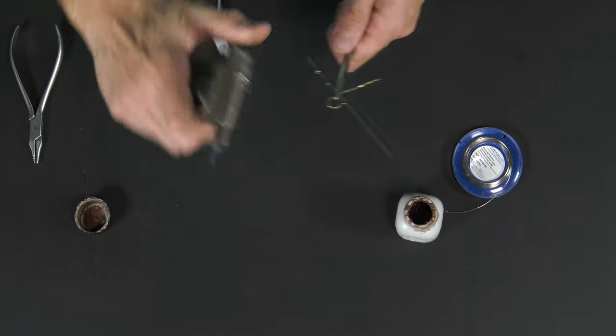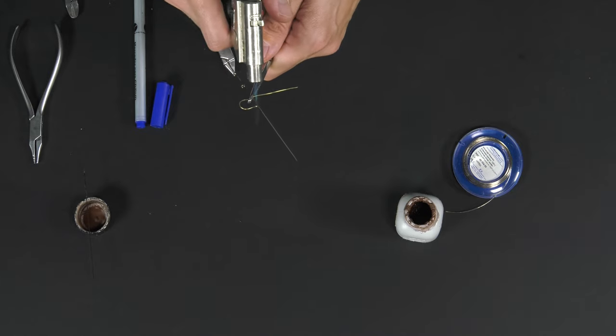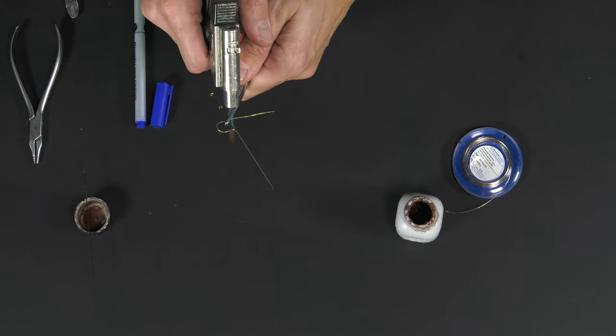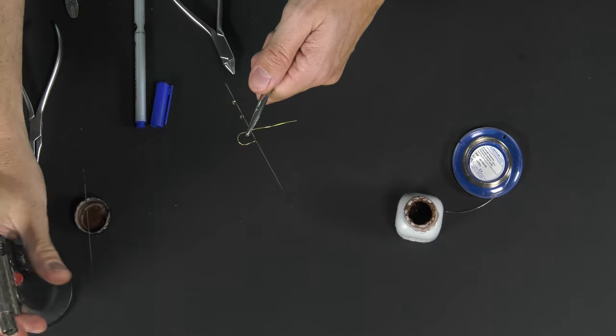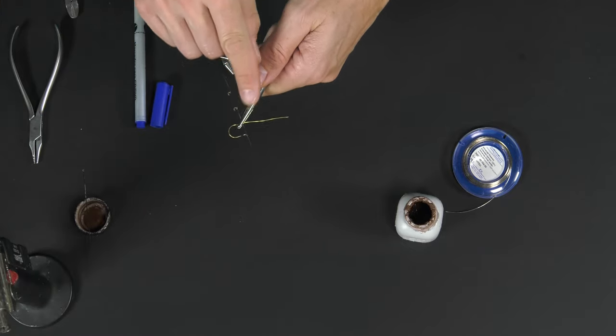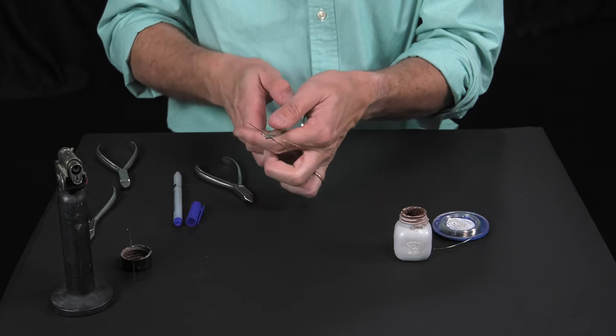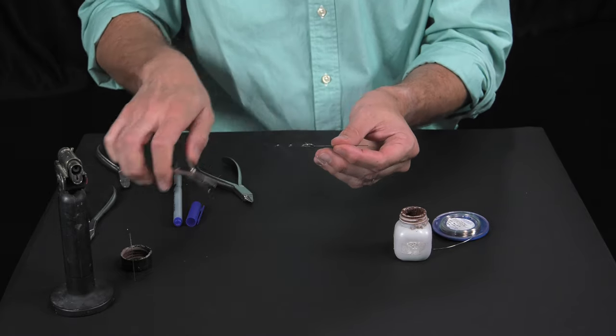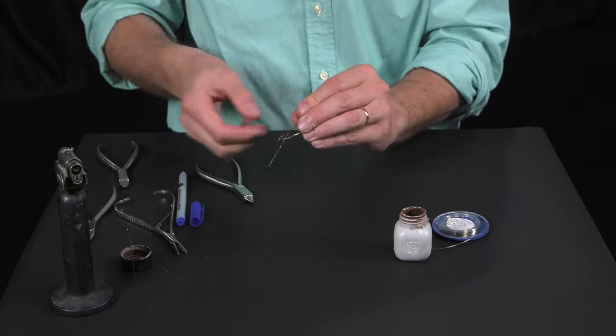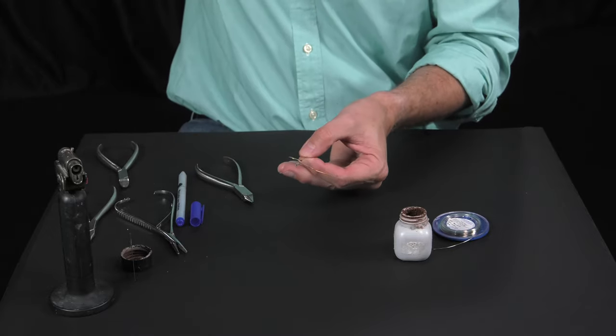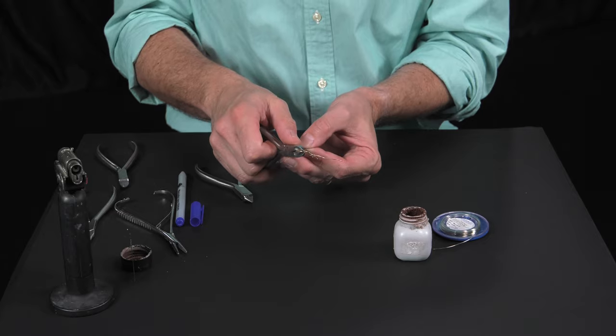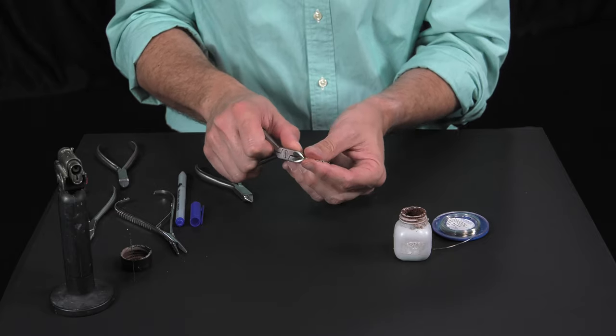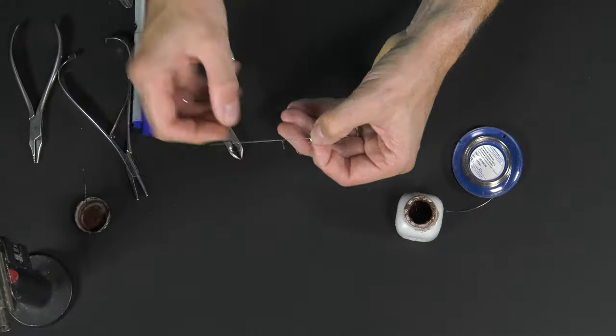We heat the brass wire to allow the silver solder to melt and flow toward the wire at the desired point. Now we remove the brass wire, we can calmly trim the brass wire to the length we want and shape the hook just as we did in the previous method.